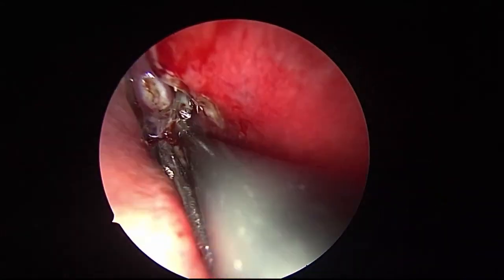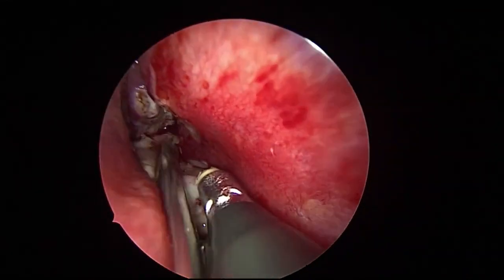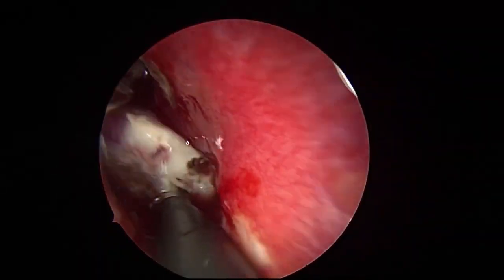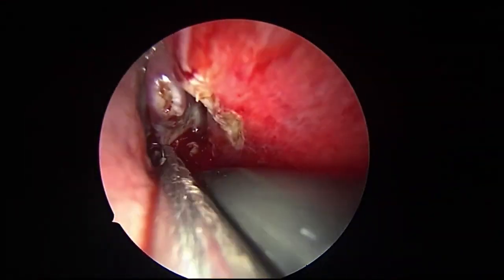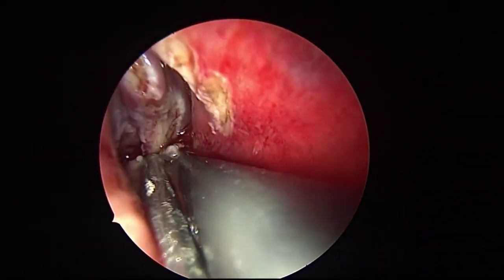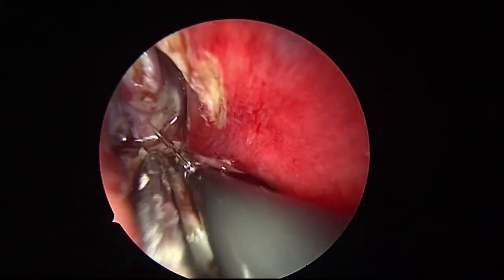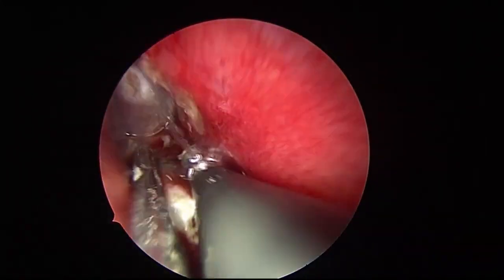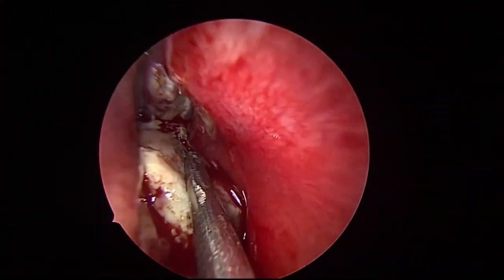See, more and more surface coagulation will help reduce the vascularity and allow the tumor to shrink. With your instrumentation, even if you inadvertently touch the tumor with your instrument, it is not going to bleed so profusely. That is the advantage of surface coagulation. More and more surface coagulation improves your visualization.